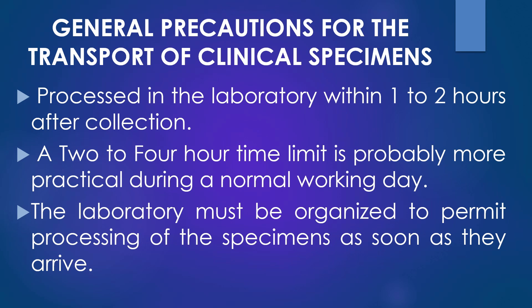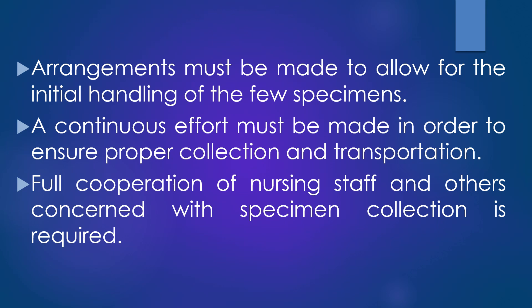Next, general precautions for the transport of clinical specimens. Most specimens should be processed in the laboratory within 1 to 2 hours after collection. In practice, a 2 to 4 hour time limit is probably more practical during a normal working day. The laboratory must be organized to permit processing of the specimens as soon as they arrive, and the collection of most specimens should be limited to the working hours of the laboratory. Some arrangements must be made to allow for the initial handling of the few specimens that have to be collected outside of the laboratory working hours.